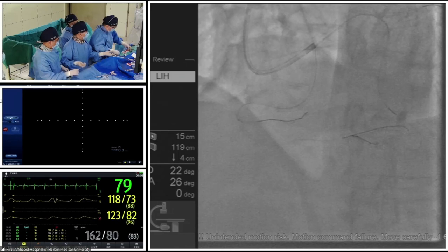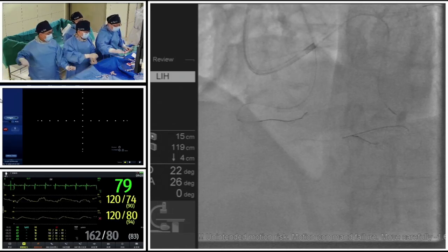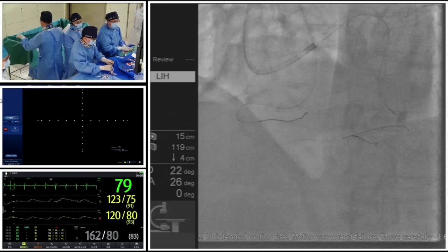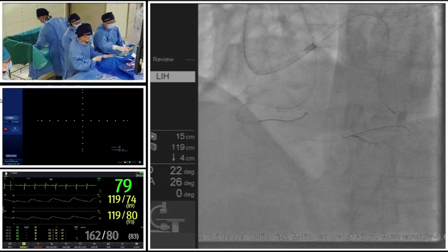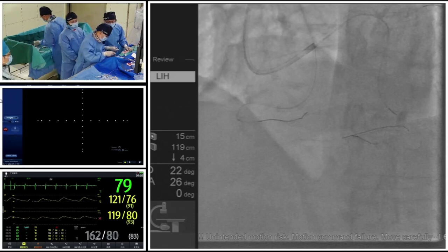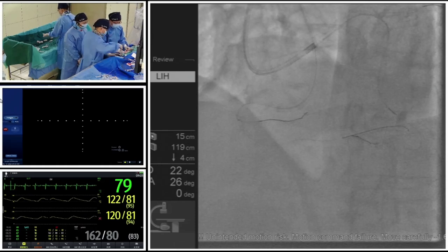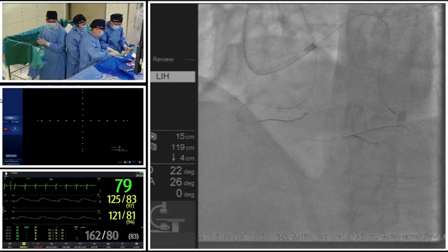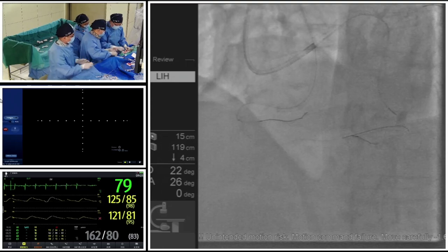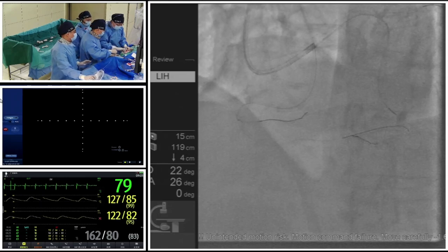From the angiography, I think that we are in the PLV, or at least the sub-branch of the PLV, with the help of the retrograde wire in the PDA. So I think we can guarantee to maintain two main branches of the distal RCA. I think we should do IVUS, and let's see if this time the IVUS catheter could advance to the distal branch.